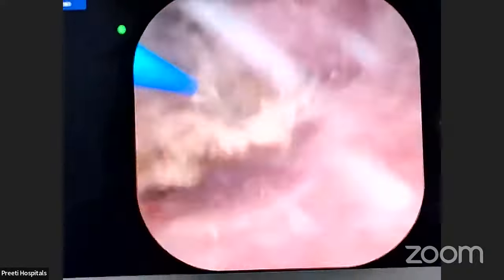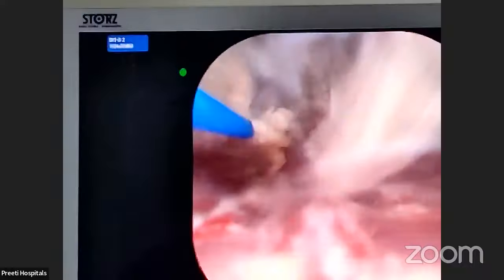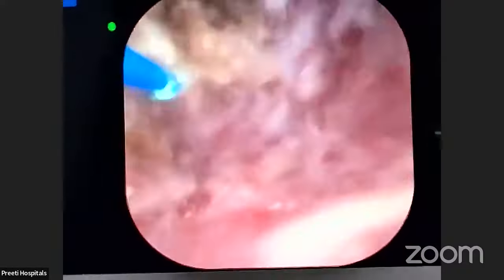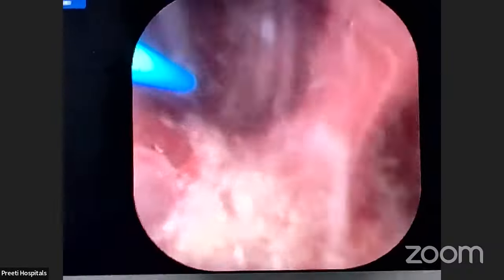See, now it has become fragments, and I will use the same fragmentation mode for the fragmentation of the stone. Everything will be sucked out. Don't try to suck out this many fragments. The pop dusting you do. What is pop dusting? When you make fragments, those fragments will come and touch and they will become powder. See this powder, you suck it out. See how you're sucking out powder now.